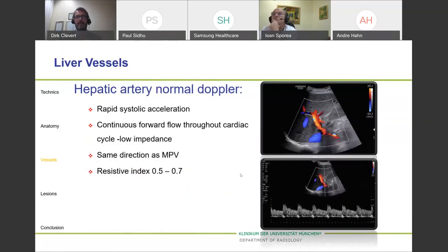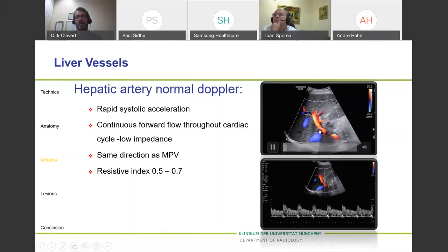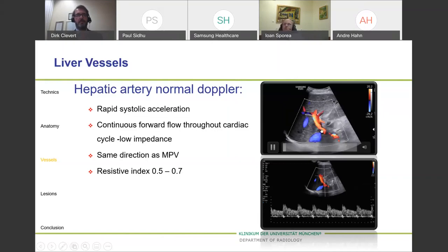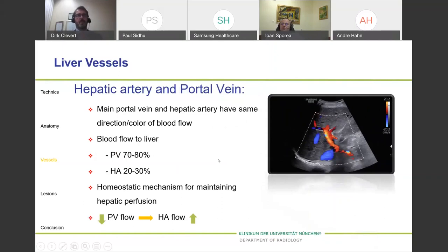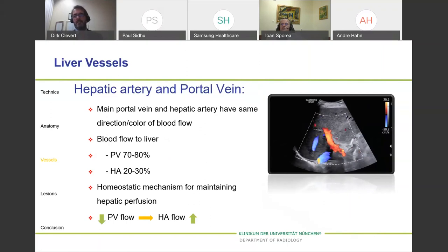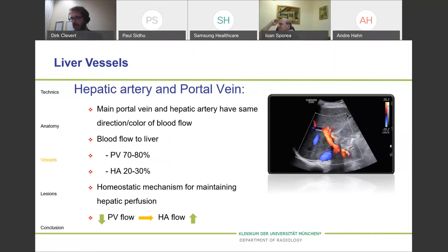The hepatic artery has a slightly different pattern. The hepatic artery is adjacent to the portal vein, and the flow direction is the same as the portal vein. To exclude portal hypertension, make sure the flow direction between the hepatic artery and the portal vein is the same. Sometimes if you have portal hypertension, there will be inverse flow in the portal vein, then coded in blue. The portal vein is responsible for around 70 to 80% of the blood supply of the liver; the hepatic artery accounts for only 20 to 30%.